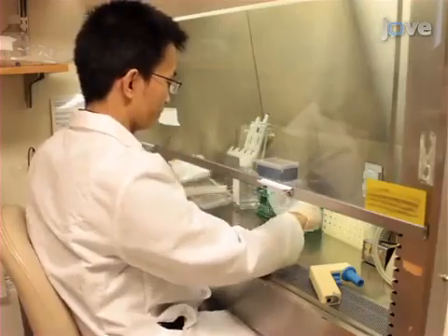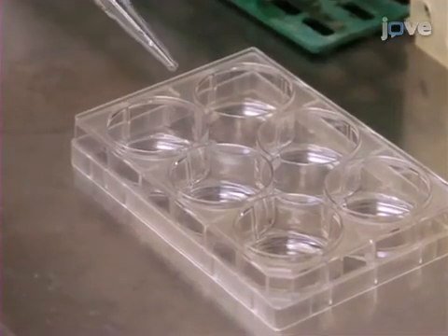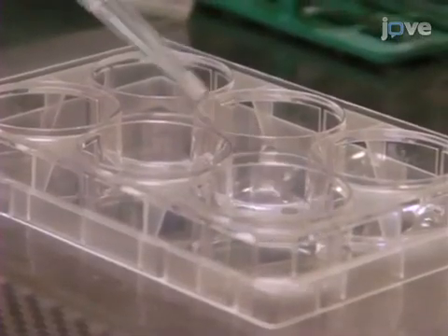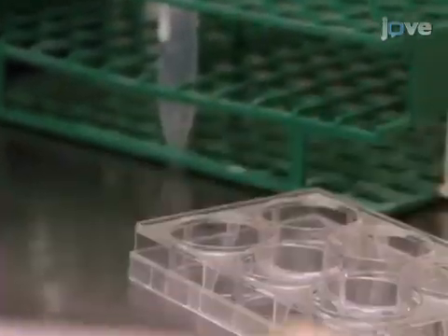To prepare for culturing stem cells, coat the bottom of each well of a six-well plate with poly-D lysine. Allow the plates to dry in the hood. Once the wells are dry, rinse with sterile water and aspirate, then allow the wells to dry again.